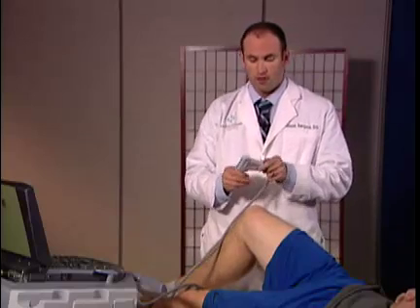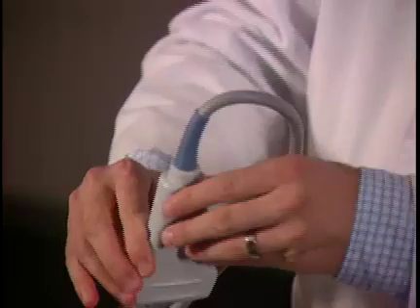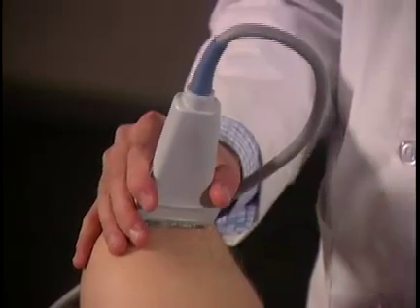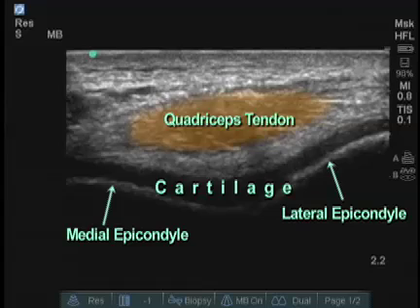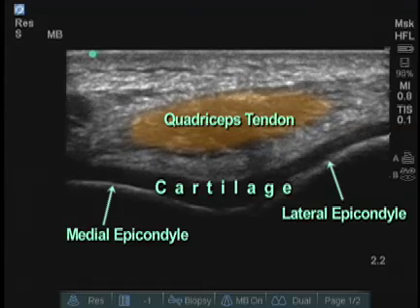Next, we're going to take a look at the patient's cartilage with the knee in the flex position. By holding the transducer with the notch facing towards the patient in the medial position, I'm placing the probe in cross-section just above the patient's patella. Here I see a clear image of the patient's medial and lateral epicondyles with cartilage shown in the area of blackness.